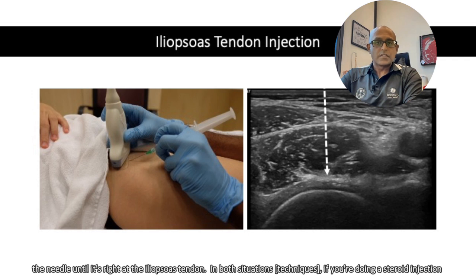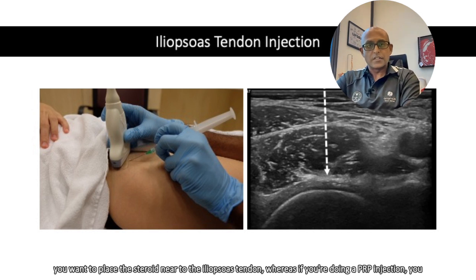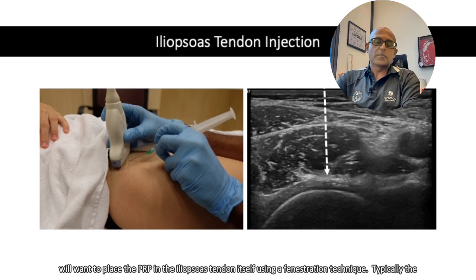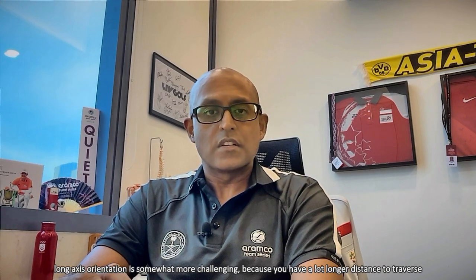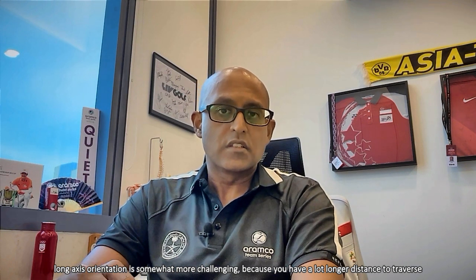In both situations, if you're doing a steroid injection, you want to place the steroid near the iliopsoas tendon. Whereas if you're doing a PRP injection, you will want to place the PRP in the iliopsoas tendon itself using a fenestration technique. Typically, the long axis orientation is somewhat more challenging because you have a lot longer distance to traverse and it will be somewhat more challenging to achieve.